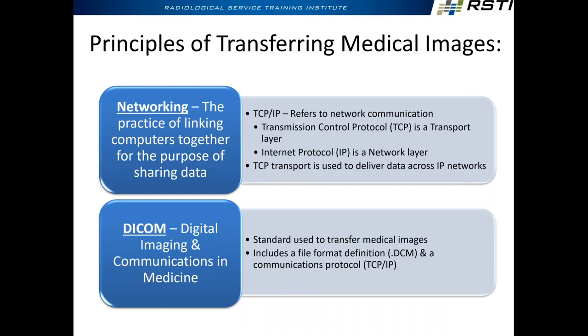I gave the date example previously as an example of that. So DICOM is just a set of rules and regulations that standardize the format of the data. We still rely on TCP/IP to get the data from point A to point B. Why did I mention this? Because if you can't ping something, DICOM is not going to work, right? You're probably all aware that the network has to work fundamentally first. Hardware, the switches, the backbone, if that doesn't work, none of this stuff works. So don't worry about troubleshooting any of this port number, AE title stuff if you're having hardware communication problems.